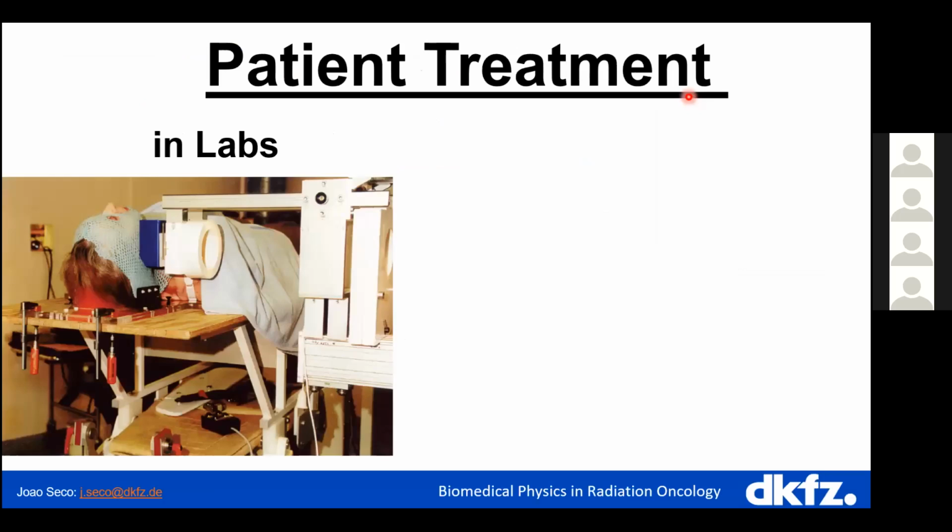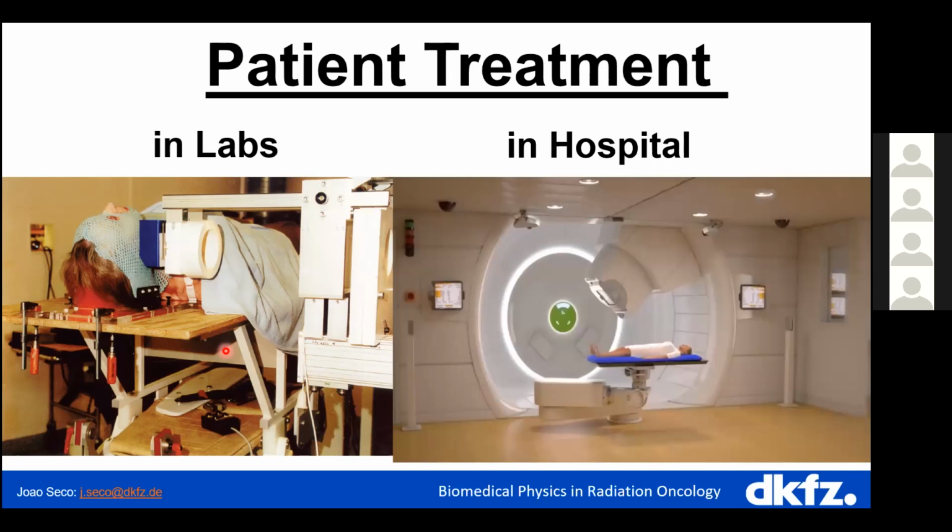So let's look at how it used to be, right? Radiotherapy in the particle center used to be like this. It used to be almost like a physics laboratory. So you see the patient here, and you see almost like a lab in the physics department where you're putting things together. This used to be around in the 90s or even before. This is now modern particle therapy in a proton center. So it's completely different. You have to remember that the patient is usually very sick. You want to give the person a very quiet environment where she can be treated, and you want minimal fuss around the whole process.